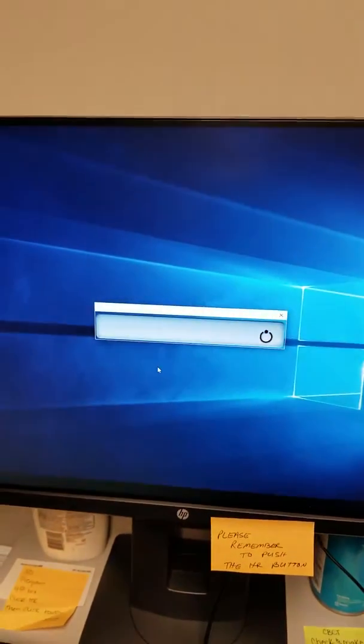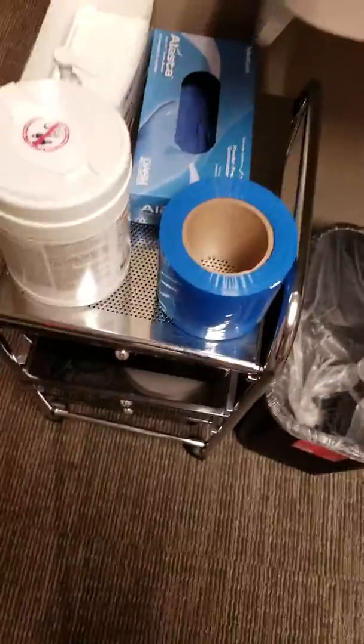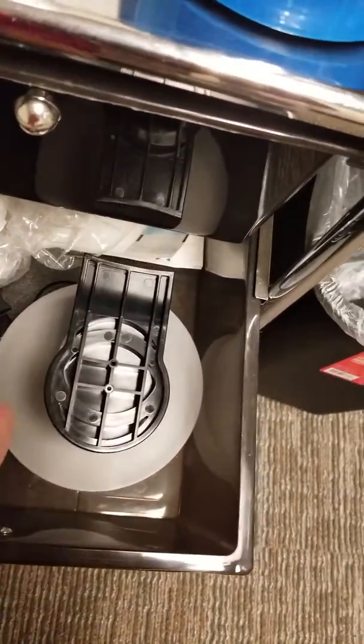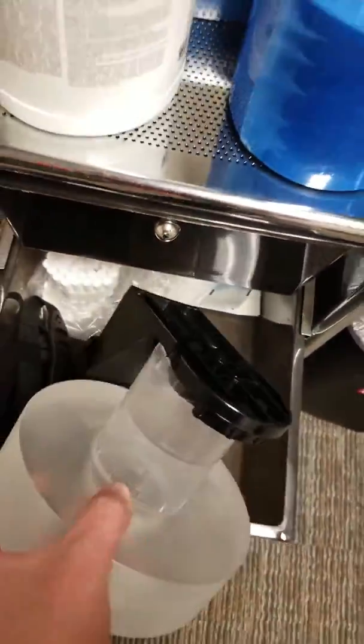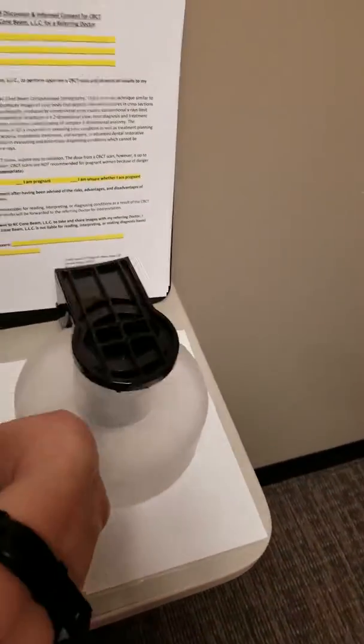We'll allow it. While this is coming up here, I'll show you the little piece that we'll use is in this middle drawer here. So I've got it all together. All you should have to do, right now it's upside down from how it will be on the machine. So it looks like that. Otherwise it will be in pieces. We'll just set that right there for now.